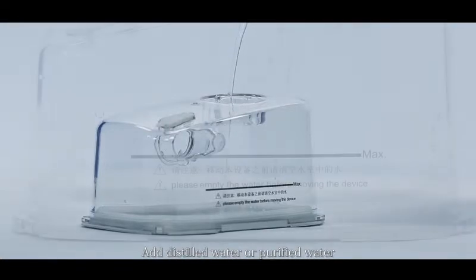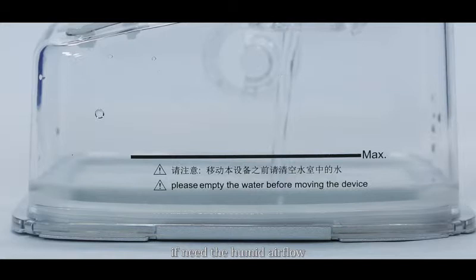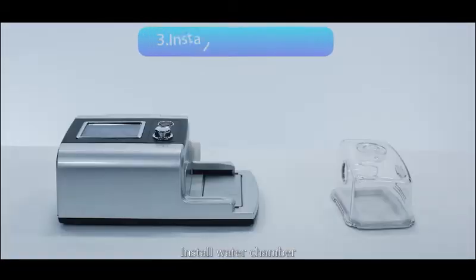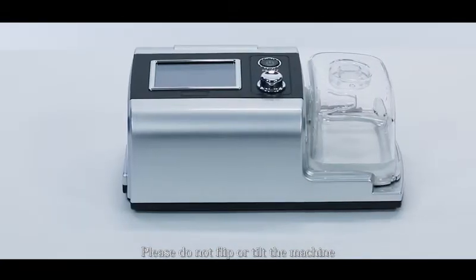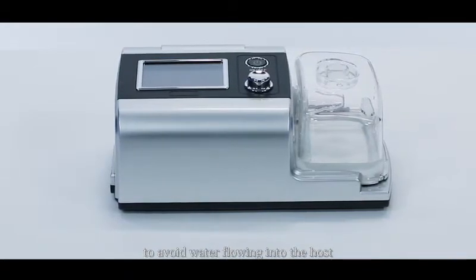Add still water or purified water. In winter, if you need humid airflow, we recommend adding water at less than 35 degrees Celsius. Please keep the water line under the maximum line marked on the water chamber. Install the water chamber by keeping it parallel and pushing it to the end until it matches the host outlet connector. Do not flip or tilt the machine after installing the water chamber to avoid water flowing into the host.